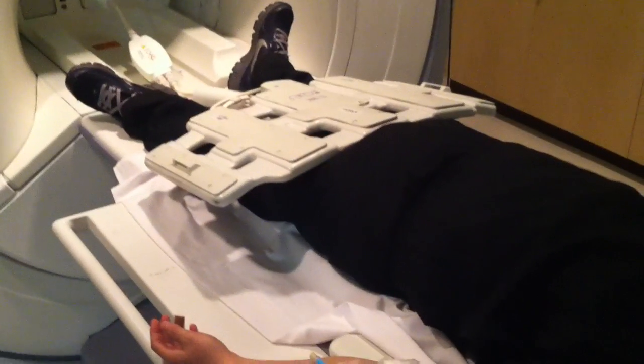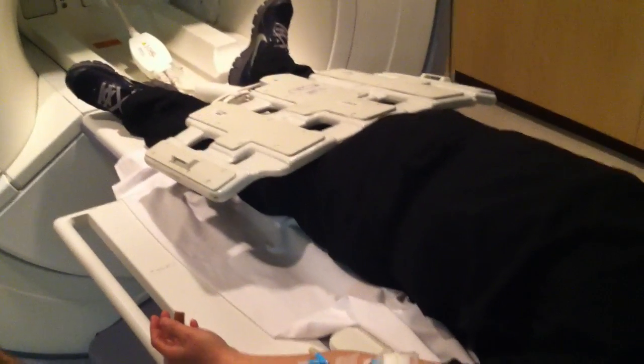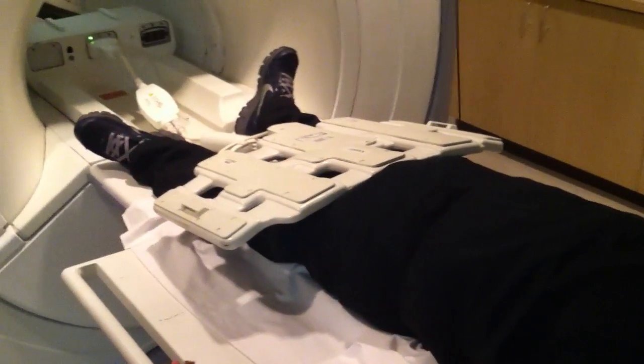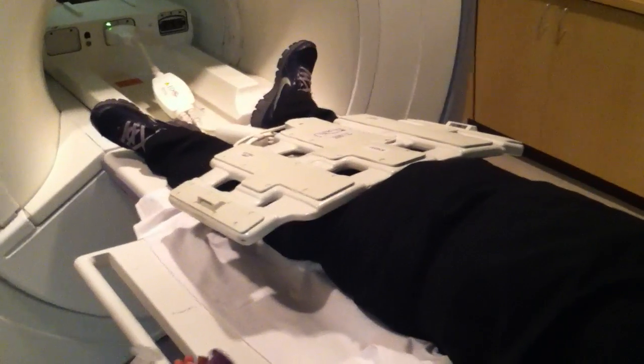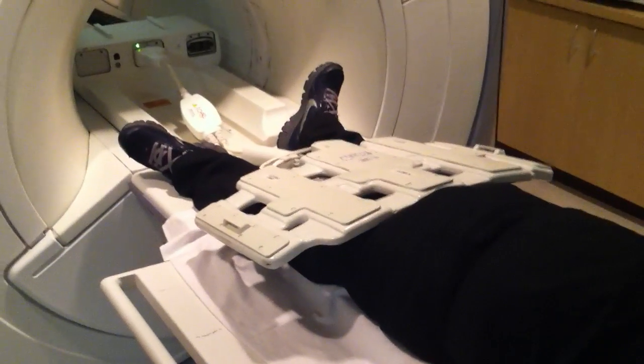Okay, this is how to do an MRI of the liver, otherwise known as a multi-phase liver. This video is going to teach you how to set it up and scan.